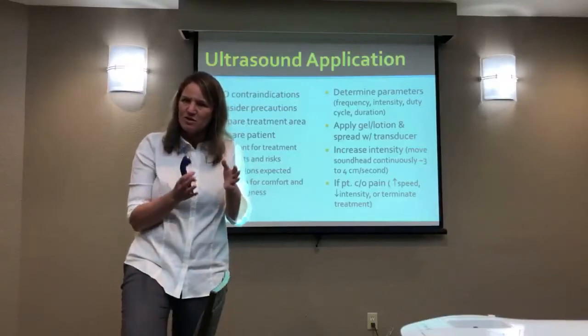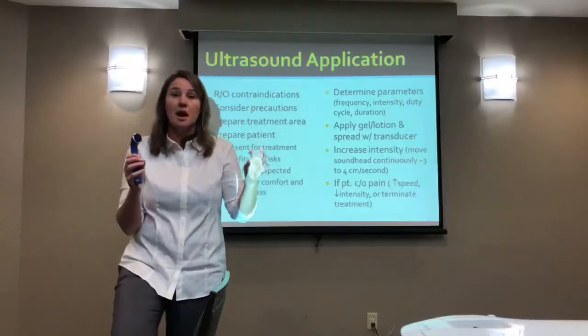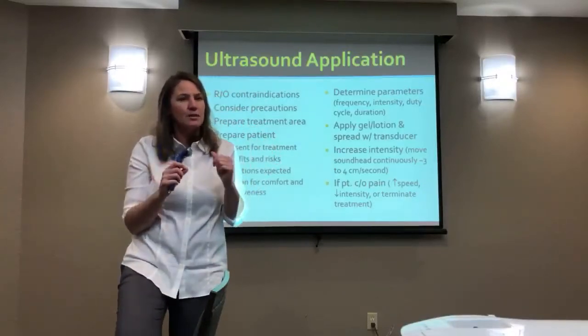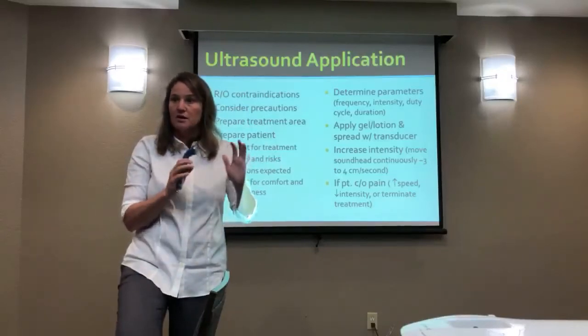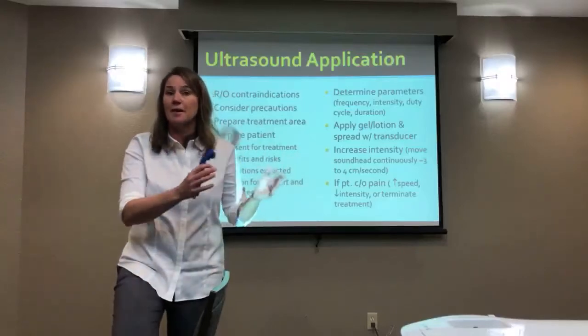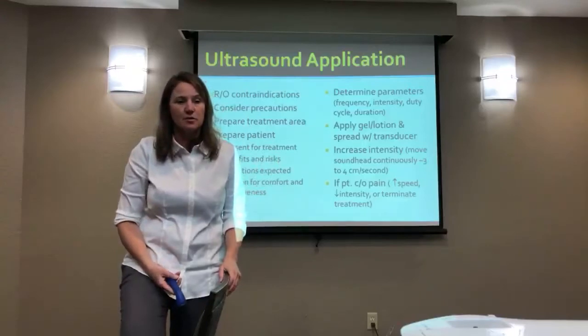I would try to focus on what you're doing. A lot of people, I have a hard time not talking at any time in my life, but if I'm talking to the patient while I'm doing the treatment, I'm going to make sure that I'm being careful to pay attention to what I'm doing, this short treatment, to make sure it's effective. So if I'm going to talk to them, hopefully I'm talking about what we're doing in order to make it as effective as possible.